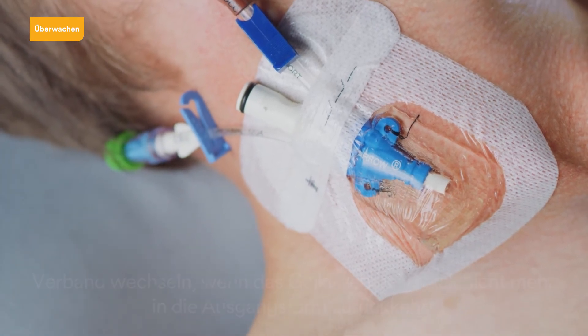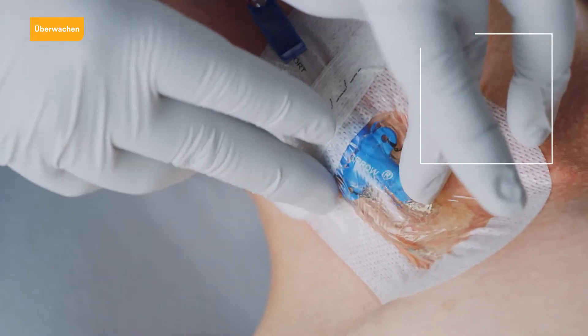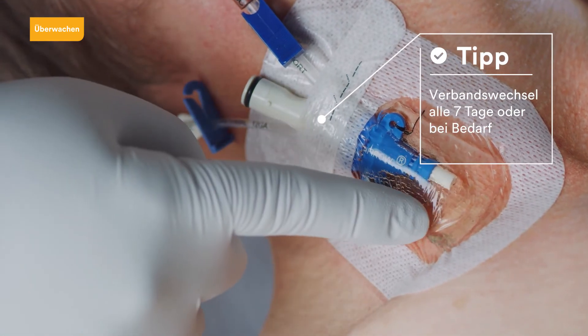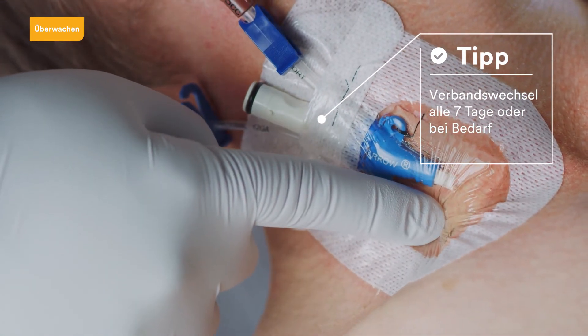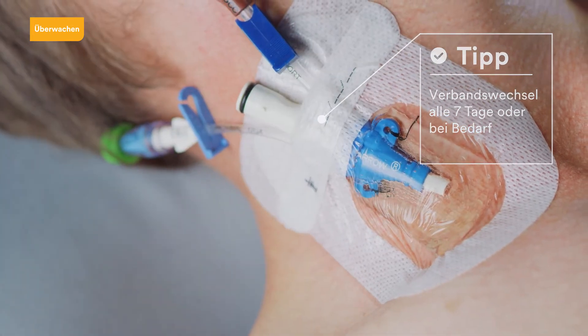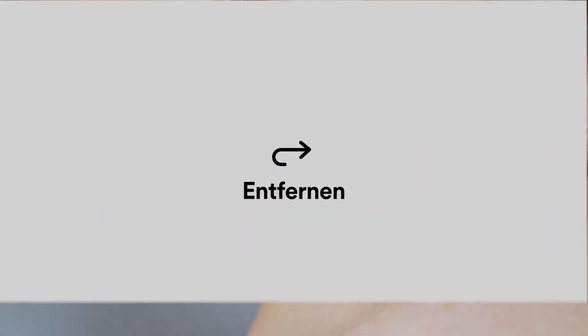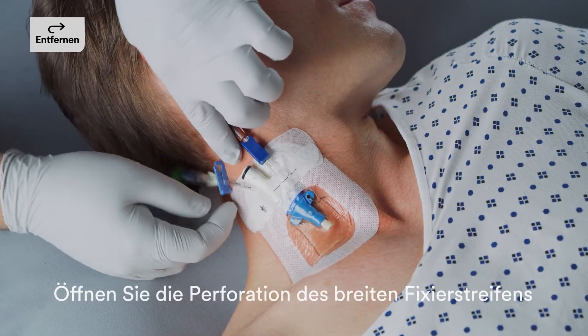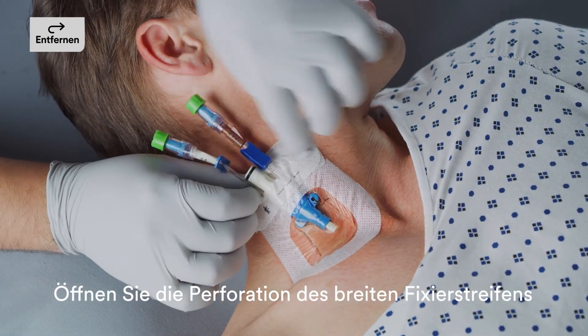The dressing should be changed if the gel pad remains displaced when pressed with a finger. Change the dressing every seven days, when the dressing becomes loose or soiled, if the gel pad is saturated, or in cases where there is swelling, visible drainage, or lost visibility.